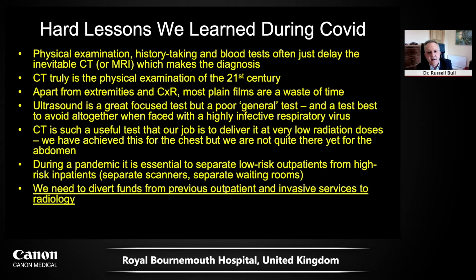Well, we did learn some hard lessons during COVID. Physical examination, history taking, and blood tests. We all love them, and we all went to medical school, but they often don't actually give you the answer. They often just delay the inevitable CT or MRI, which does make the diagnosis. It pains me as an ex-general physician saying that, but I think that's true. CT, I think, really is the physical examination of the 21st century, and it picks up a lot of things that physical examination cannot.